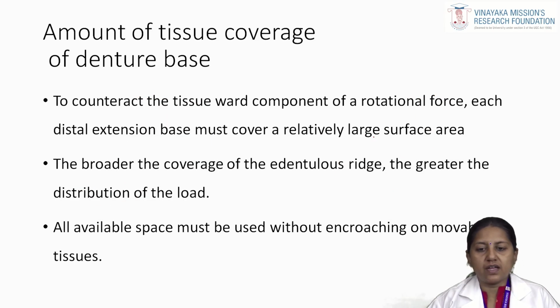The next factor is the amount of tissue coverage of the denture base. To counteract the tissue-ward component of a rotational force, each distal extension base must cover a relatively large surface area.